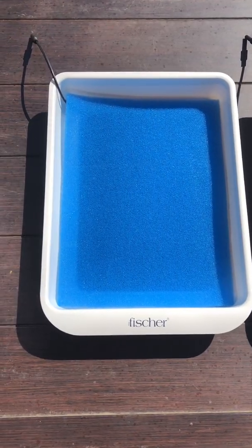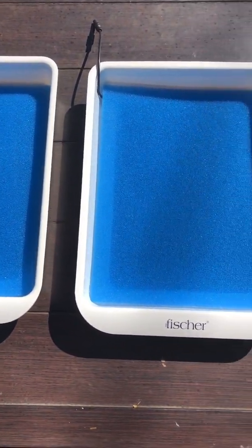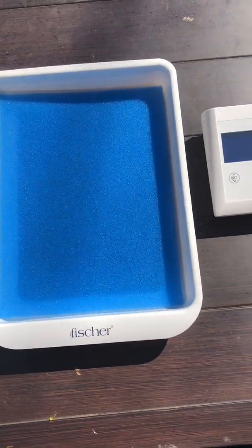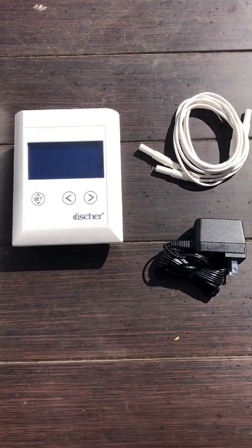Here's one final close-up look at all the components inside the box. Everything is super compact which will make for great storage and ease of use. I'm so excited to start treatment and see even better results.